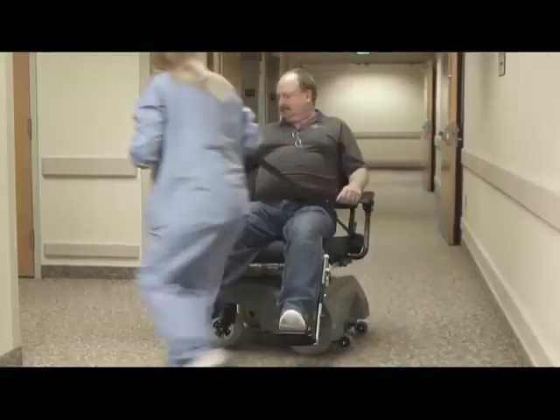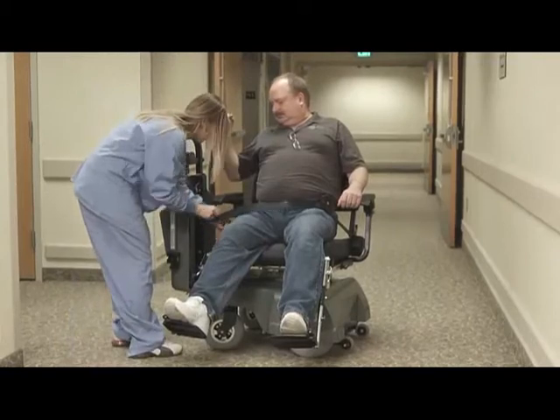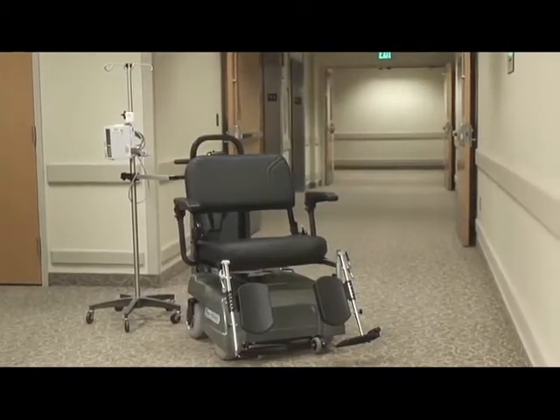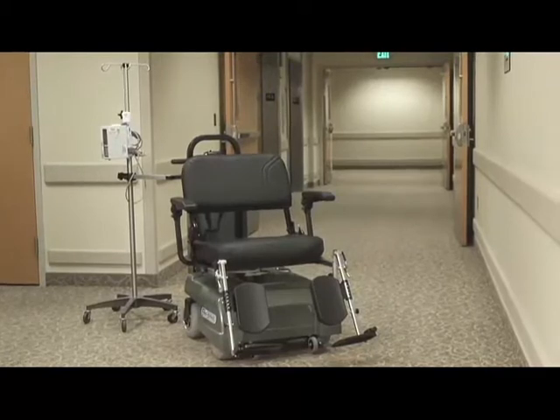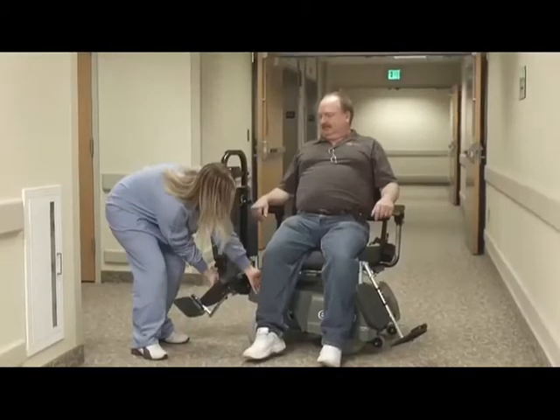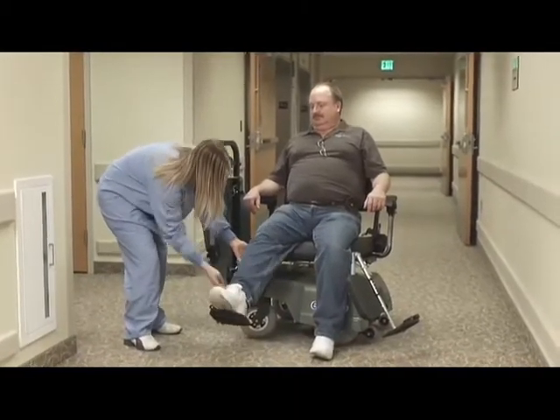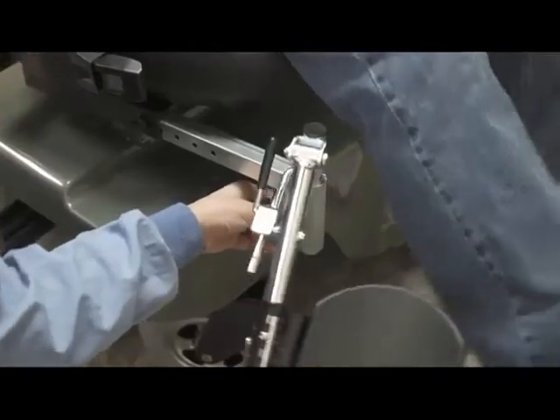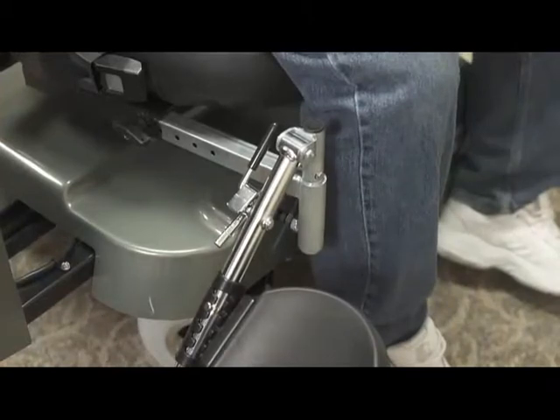There's also a seat belt for added safety. The optional IV stand hook holds the IV so you keep two hands free to operate the chair. The optional height-adjustable leg rests also keep the patient comfortable. Pull the lever to release the leg rest for the patient to get in or out of the PTC.